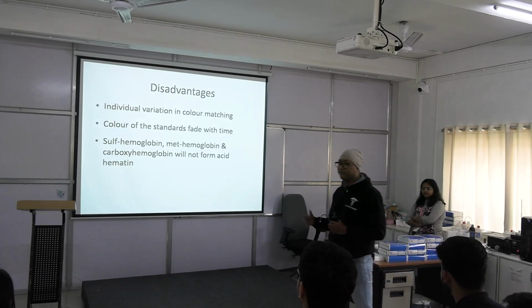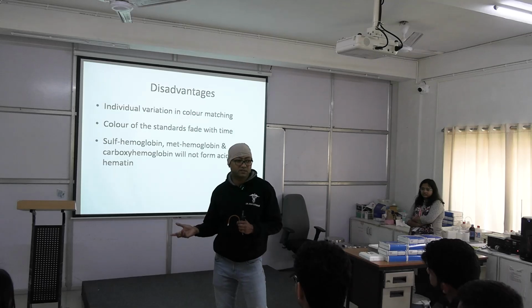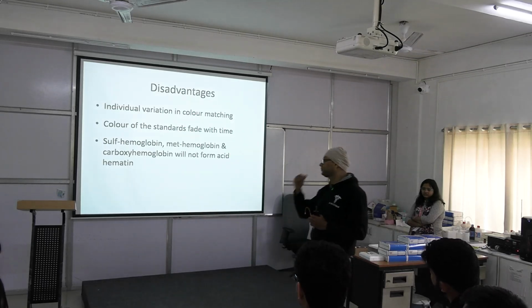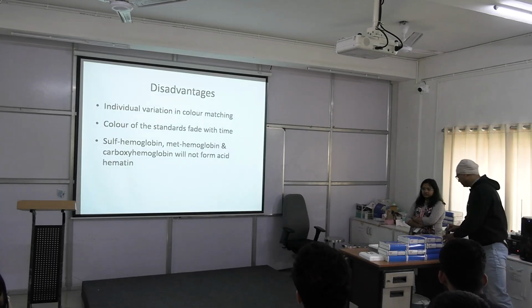ठीक है, तो definitely आप जब एक village में 10,000 population को screen करोगे, आप cyanmethemoglobin method या colorimetric method, photoelectric method आप नहीं करोगे, right? Clear? Spectrophotometric method आप apply नहीं करोगे because these are costly. Okay, so this is the thing.